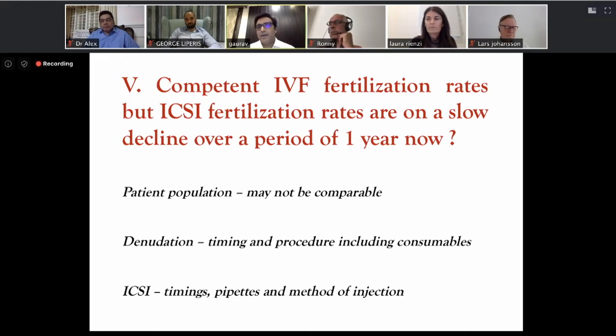Do you think, we understand from what you said that too aggressive is not good, but do you think going too soft also maybe affects fertilization rates in the long run? Look, I think that first of all, we have to understand why fertilization rate after ICSI has decreased. Is it because the degeneration rate increased? Then I would think about too much aggressive ICSI. Is it because you have no activation at all? Then I would say maybe you are too soft and you're not activating or you're not breaking the membrane. So do you have 1 PN or 3 PNs? It is different. So fertilization is the 2 PN rate.